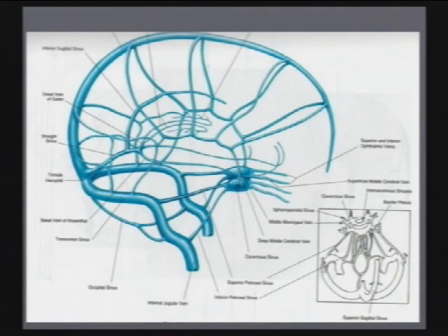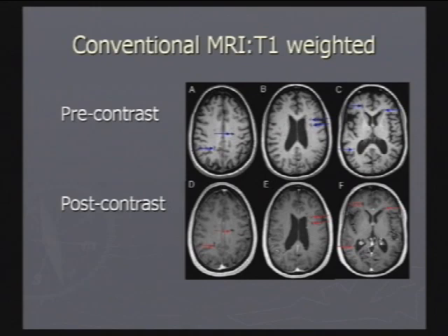This is another example, in this case, of something we call a T1-weighted MRI scan done pre- and post-contrast. Often the neurologists will look at this because they want to see if there are any new lesions or acute lesions that have developed since the previous time. And if there is any leakage of the contrast agent, that's usually a marker of acute lesions. So again, that's one of the advantages when I show you the MR venograms that we're going to look at shortly: at the end of the venograms, we can recollect this data and also get this information that the neurologist would have wanted anyways.